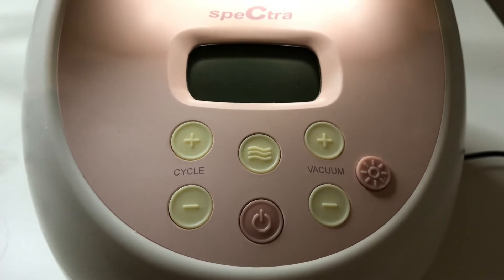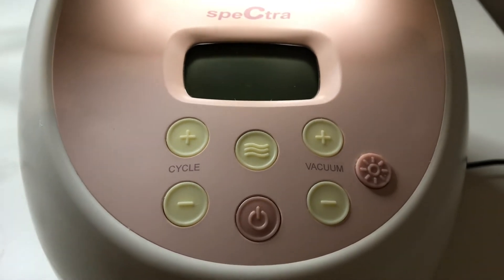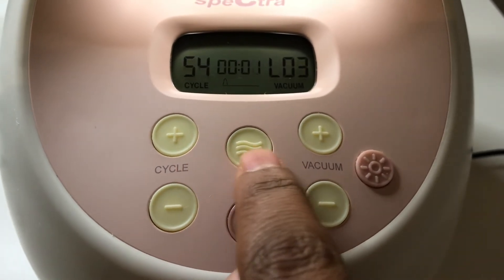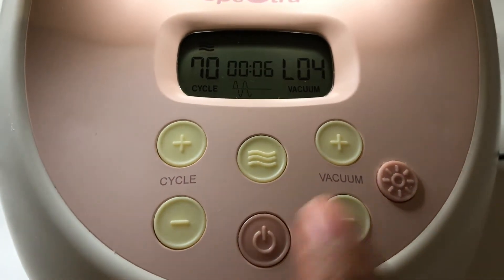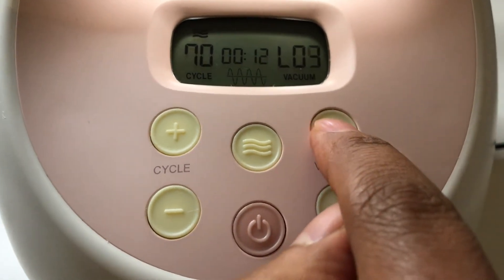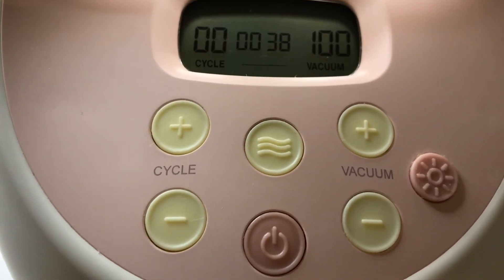Press the buttons in this sequence to get the total hours pumped with your Spectra breast pump. First, power on the machine. Then press the three little line button, then the cycle plus button, then the vacuum minus, cycle minus, vacuum plus, and then again the three little line button. My machine says that I pumped 38 hours with my Spectra S2 pump.